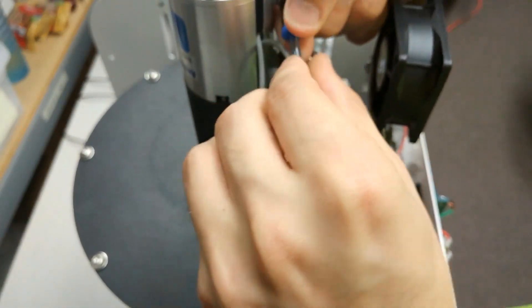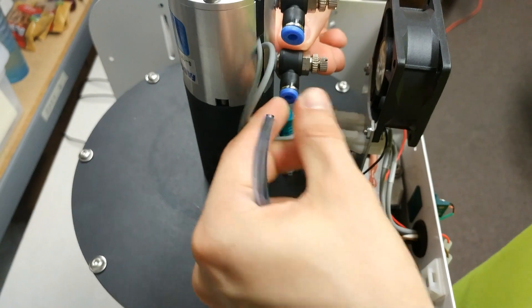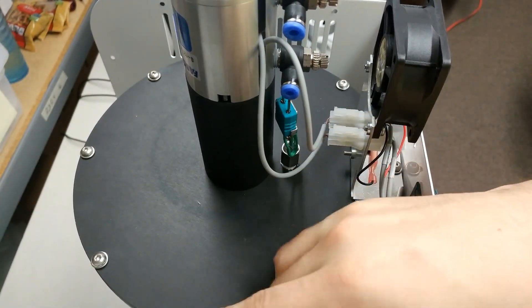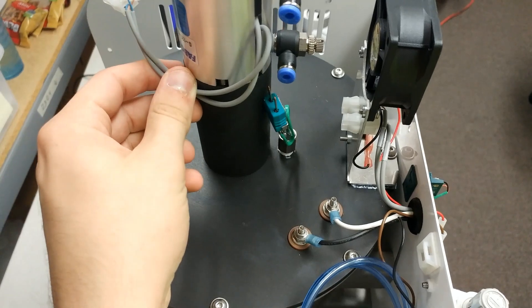Next you want to remove the air hoses as well as the press sensors. To remove the hoses, press inwards on the blue tabs and pull the hose outwards. You can set them in the slots on the side of the furnace. To undo the sensors, simply press on the little clips to unlock them and pull them out.